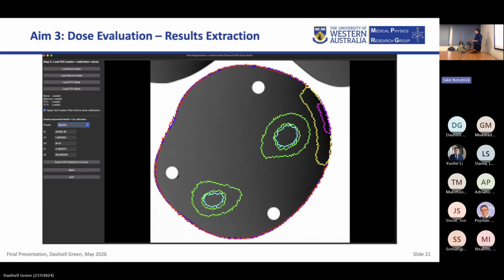So it overlays those regions of interest from the treatment planning system, and puts them into the film space. And so it's using the pixels in those regions, but from the film scan. So the calibration isn't being done on a hypothetical result? Yeah, I did a calibration myself. And that was validated against the clinical system?